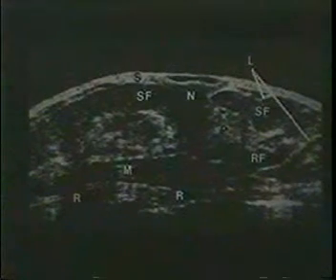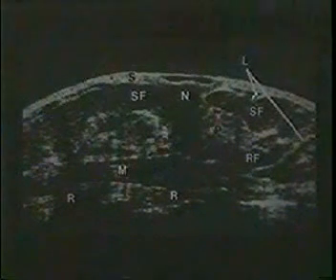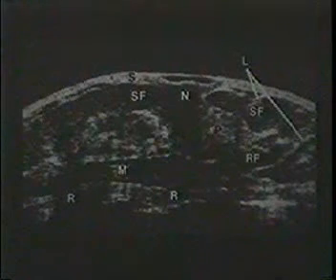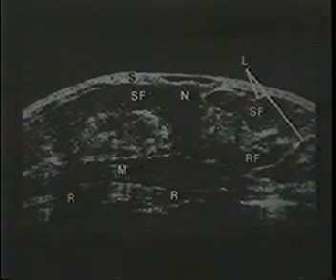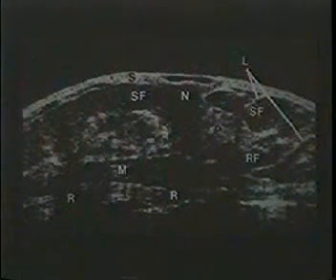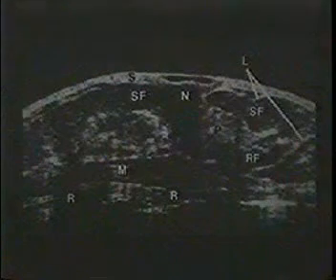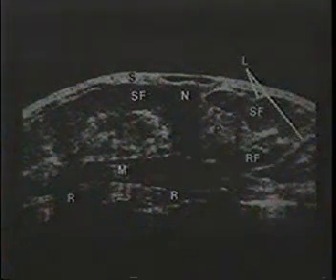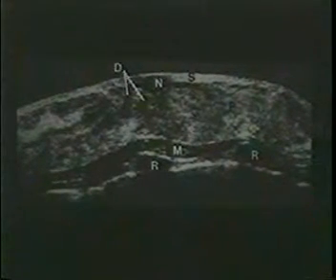In the denser breast, we can also see ligaments, which can cause refraction of the beam or shadowing behind the ligaments. But these also can be seen very well on sonography, particularly in the breast with a lot of fat in it. Now, in terms of the denser breast, it's almost primarily echogenic, and you can see that a lesion in here that had different echogenicity would show up very easily.